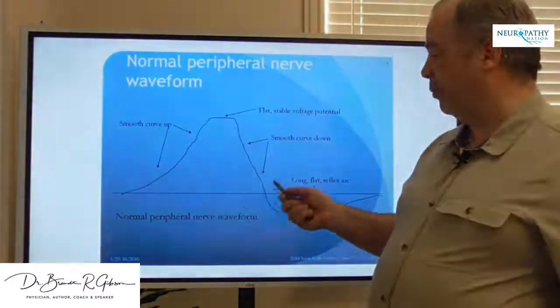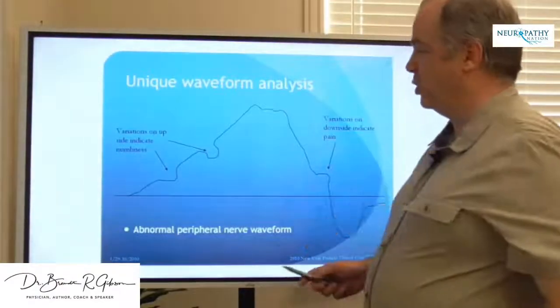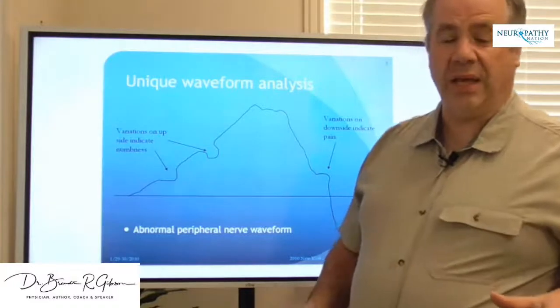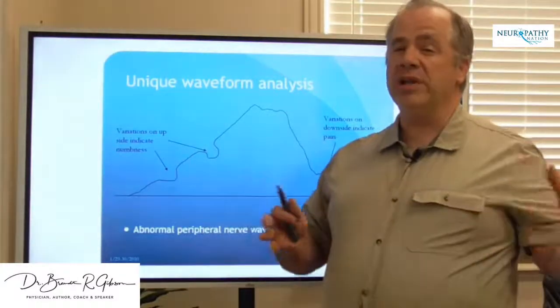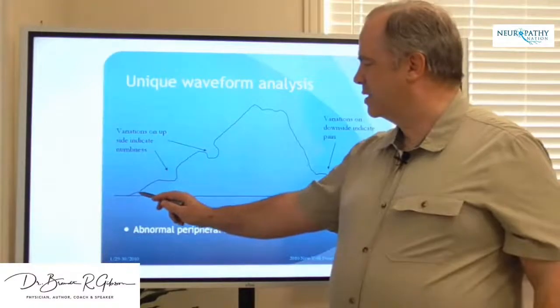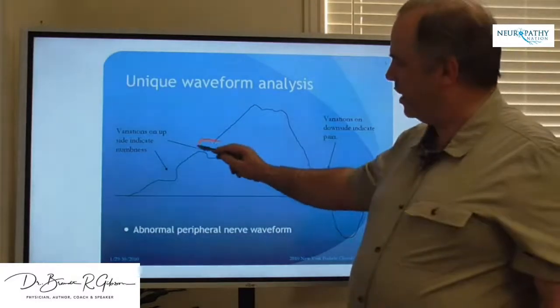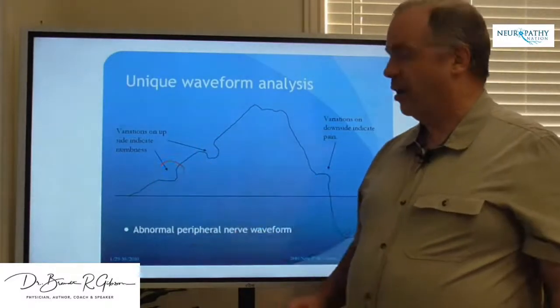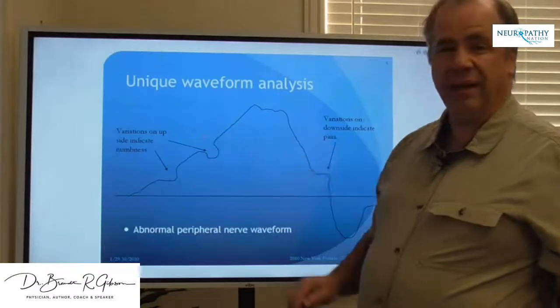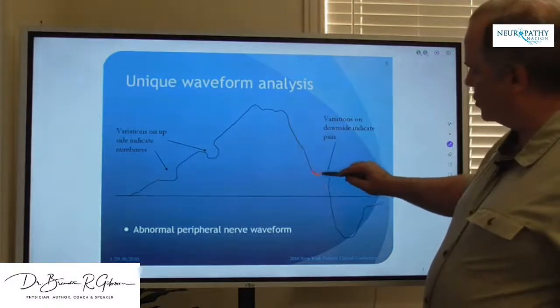That's how the normal function of a peripheral nerve waveform should be. So that's the wave. It goes above, and then it goes down, and then it comes back up, goes above, and then goes down. And it continues to do that. When you get a peripheral neuropathy, the nerves aren't actually doing that correctly. Now, this is not the re-education part. This is where it's actually fixing the nerve pain, where it's actually treating the nerve numbness and tingling and those kind of things. So if you look at this curve, if you remember, this was supposed to go up and then straight across, then come back down and do that. But what you've got is these variances that were happening causing numbness. So instead of going like this, it's dropping down, that's numbness. If it goes up like that, it would be pain. So the same thing. So over here, you can see that we're getting pain. So it's coming down. Instead of going low for numbness, it goes above for pain.